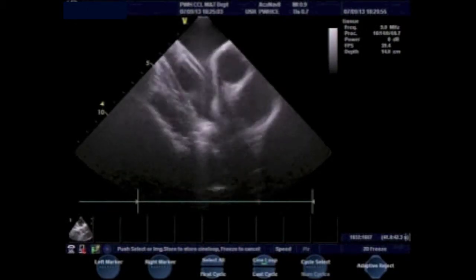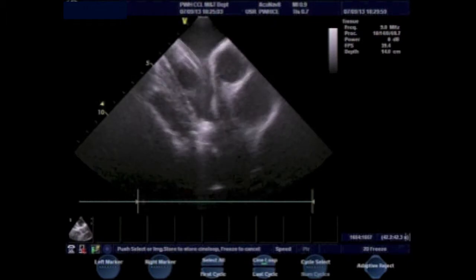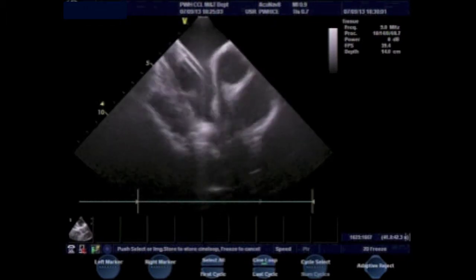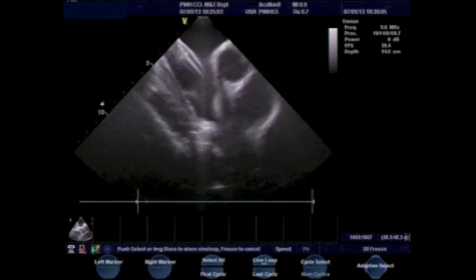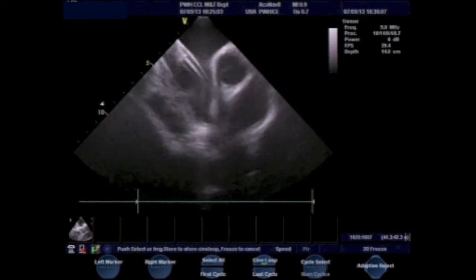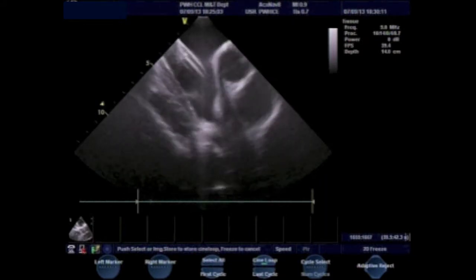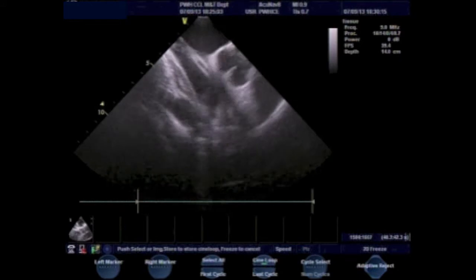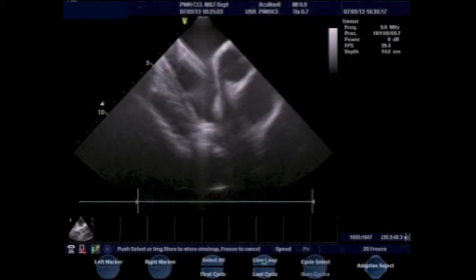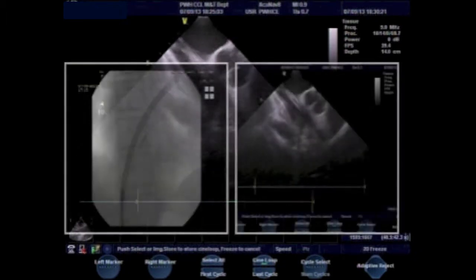So you see the short axis aortic valve. You see the sheath is across this septum, and you can see echo and fluoroscopy, picture in picture. Can we see fluoroscopy as well? Picture in picture. Lars, before you deploy the device, is the patient in AFib?